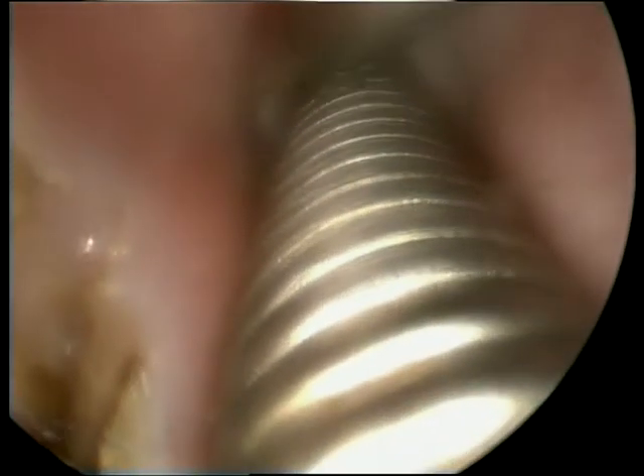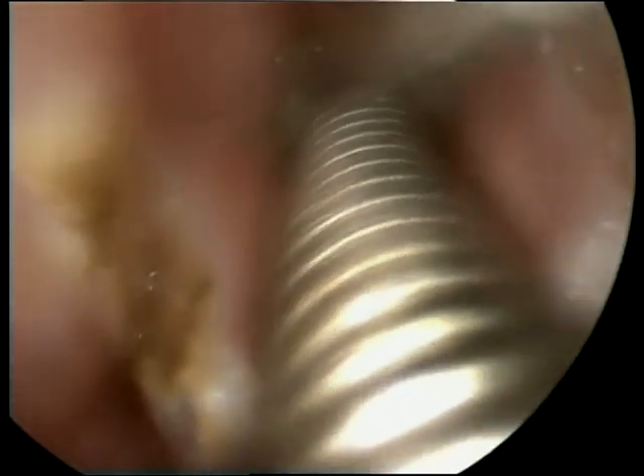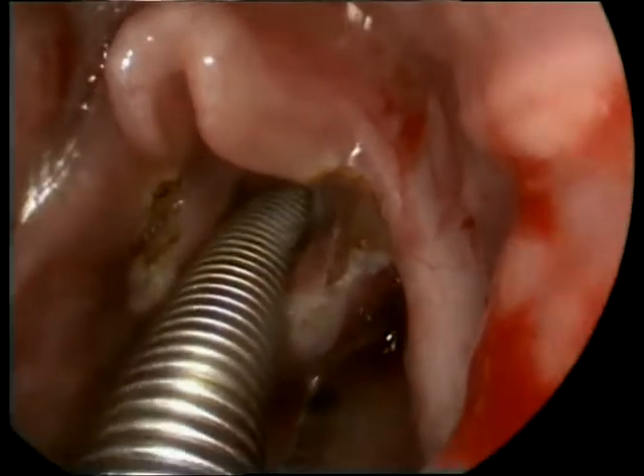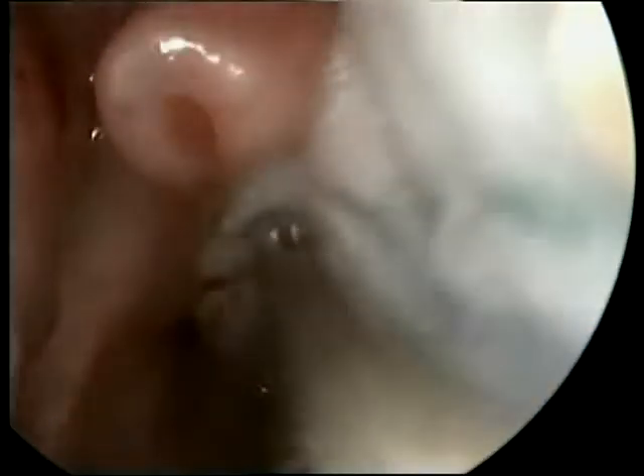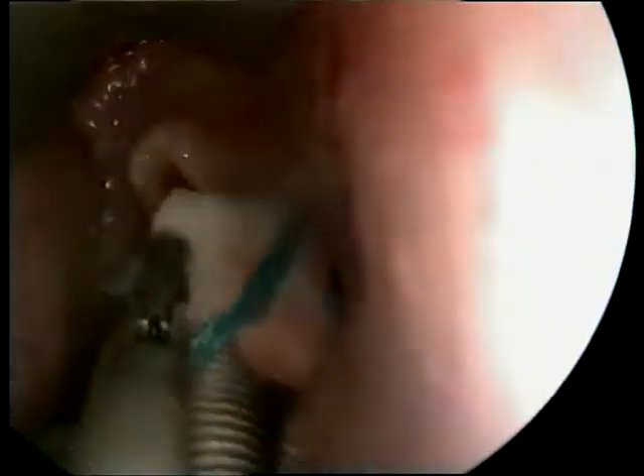Incidentally, I found a little granuloma or polypoid growth over the left vocal cord which seems to be above the cord itself, and I attempt to remove it with the cupped forceps. Technically, the surgical part of the procedure is finished and we need to change the endotracheal tube to a regular endotracheal tube, as we plan to keep the child intubated for a day or two postoperatively.